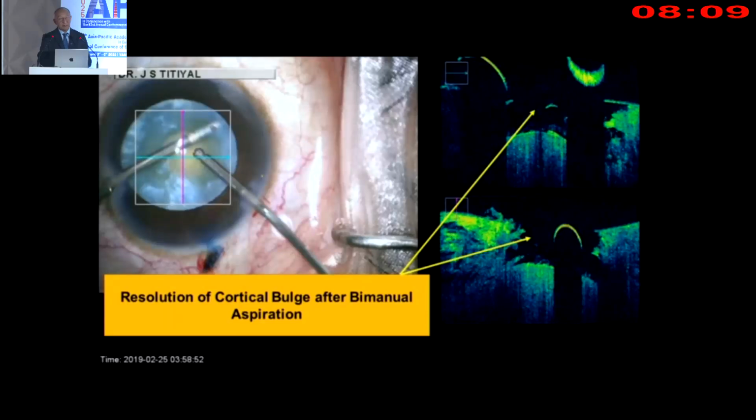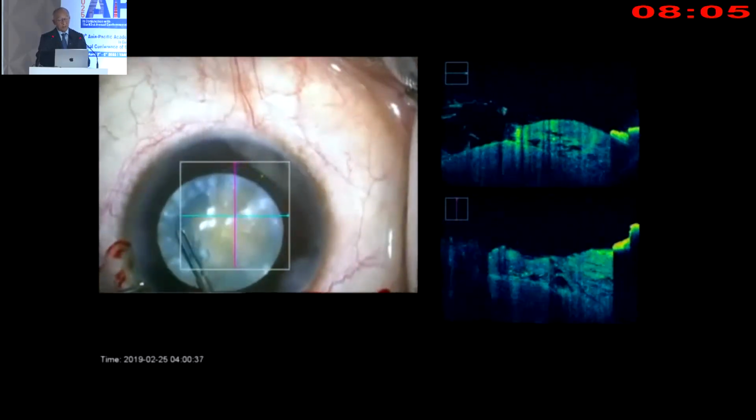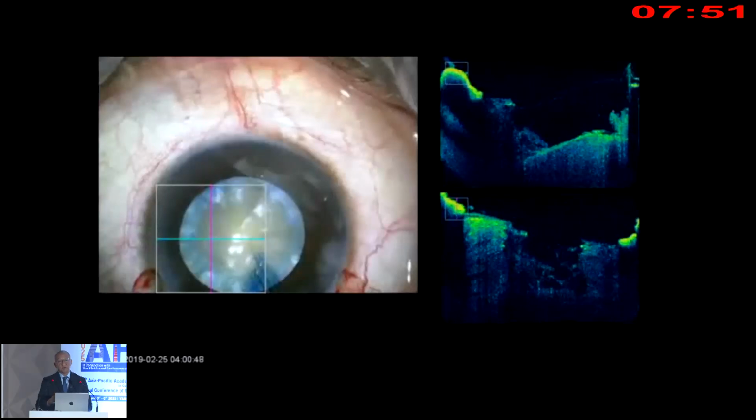That will decrease the pressure by making this convexity to concavity. Now you can fashion the rexis accordingly, comfortably with micro forceps or a needle also, to a size where you can do a nice nucleotomy and implantation in these cases. The thing to learn here was, if you have thick fibers, needle aspiration may not work. There you have to break these fibers, so you require a larger aspiration with cannulas.